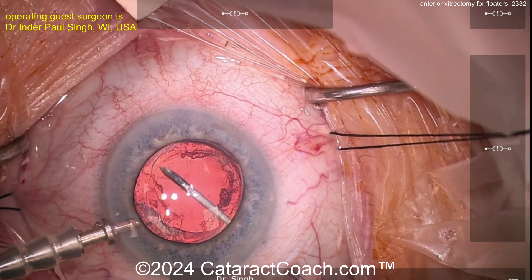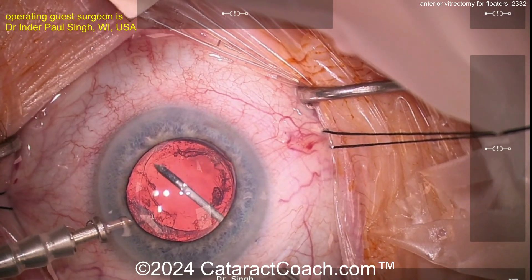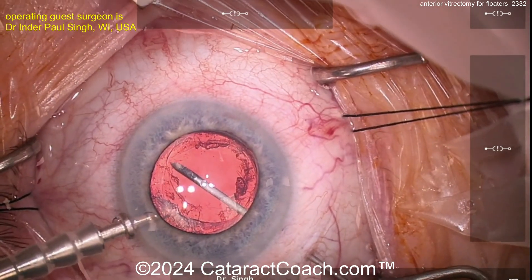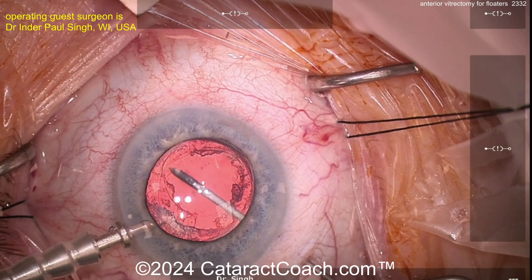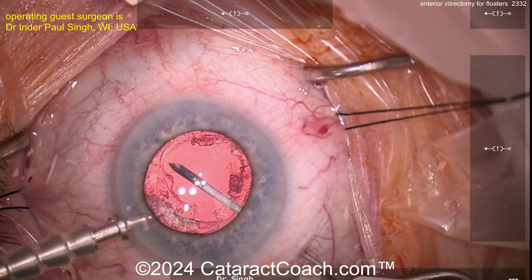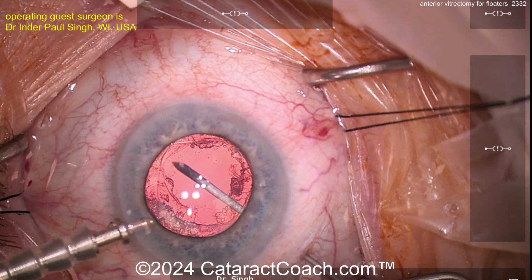Very important: after each case I'm examining with an indirect at 360 degrees, trying to get a good understanding of the retina and making sure there are no tears. It's important to inspect right after the case, the next day, and at one week to look for tears. We haven't seen any, but that's important.